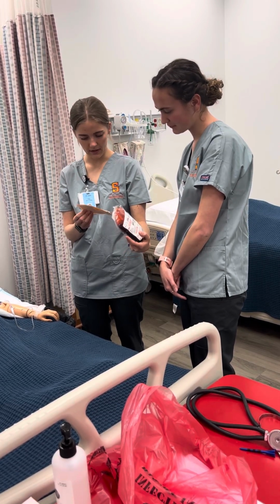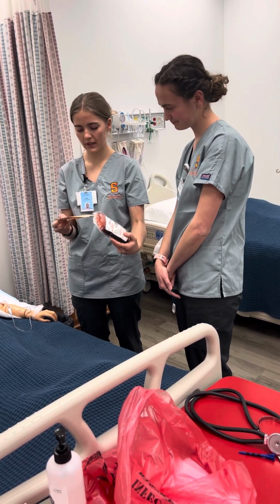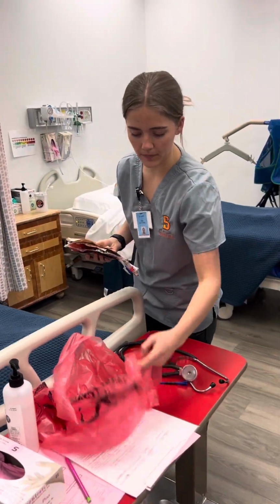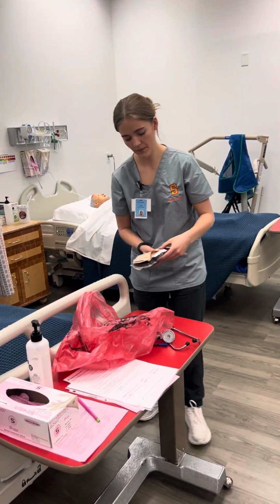And then I'm gonna go ahead and just read off this number to her. 00, and then have you read 0 to me. 88 084. Perfect. Okay. And then I just also, while you're here, just have her double check the consent form that he has signed it. Perfect. Looks good. Okay. And so we are all ready to go.